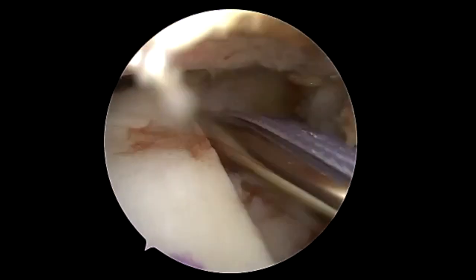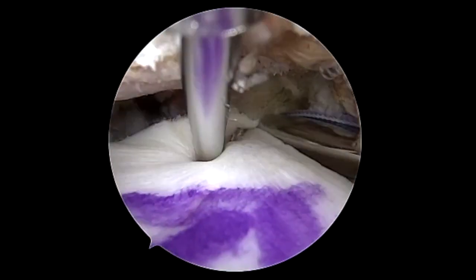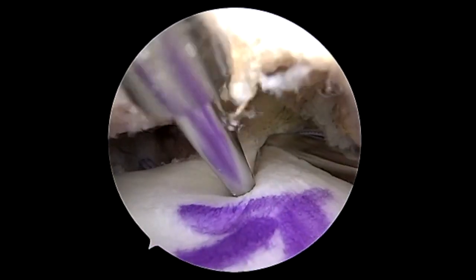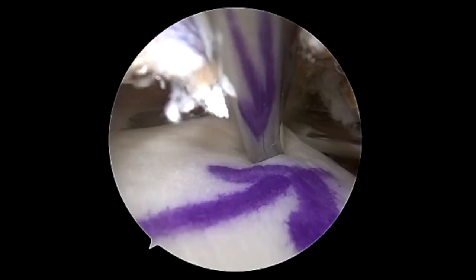You can see here this is using the CuffMend device and we have excellent placement over the cuff. We're going to go from a high superior portal and we're going to use the new shoulder fiber stitches — you can see that they are double loaded.